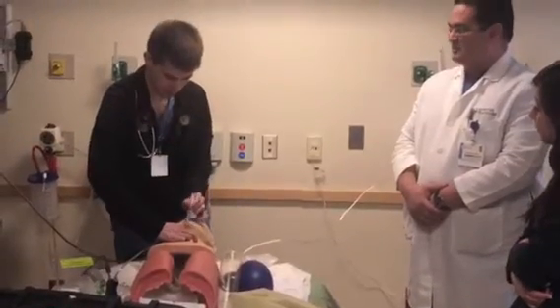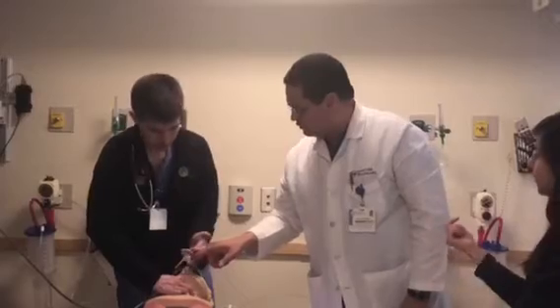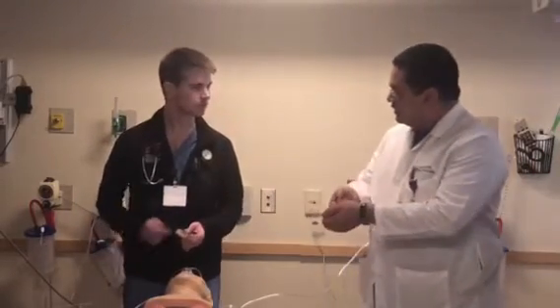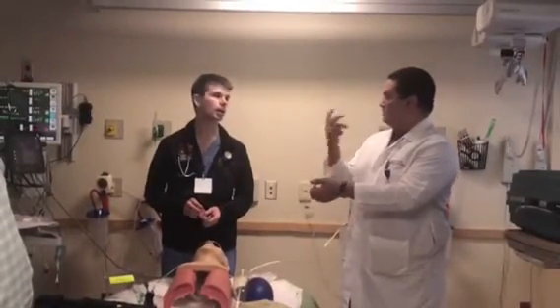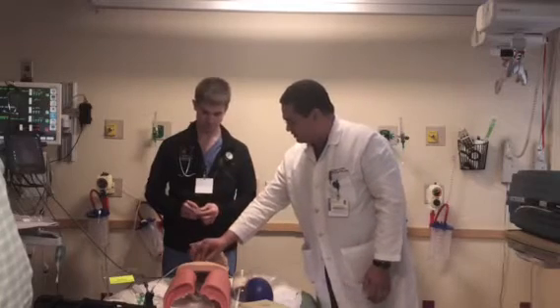So holding in the prominence, and then 60 degrees. So what's the mistake? The needle needs to be filled with fluid. So you put 2 cc's of water or fluid here. As you're going in, when you meet the trachea, you see bubbles coming in, so you know where you are, right? So we filled it with fluid, we went in, we got the bubbles.